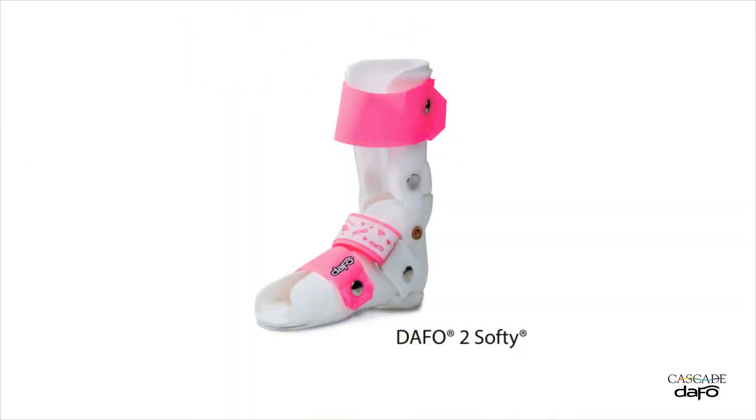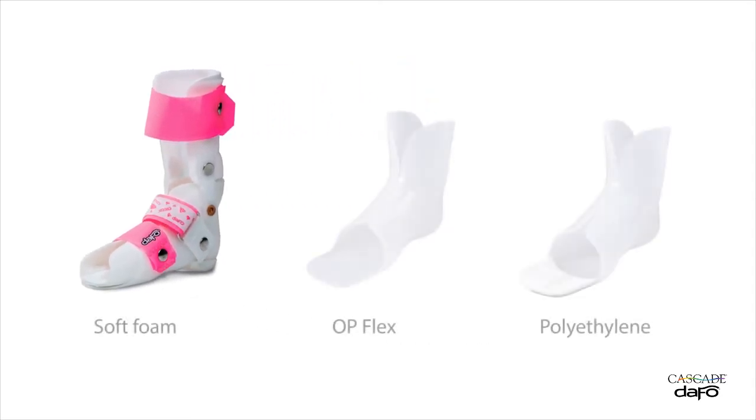The DAFO-2 Softy is a similar product, but has an inner liner for extra cushioning and support. Several inner liner material options are available, and kids can choose fun colors and patterns to deck out their braces.